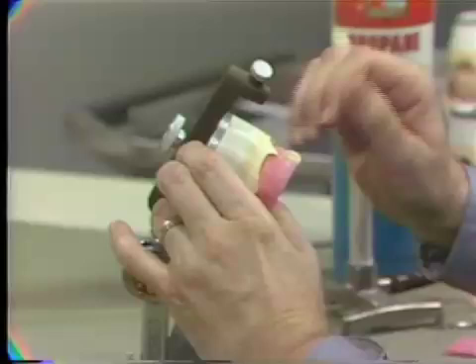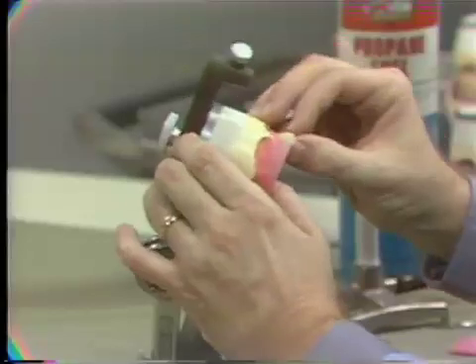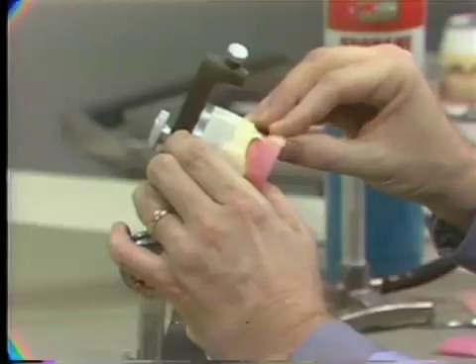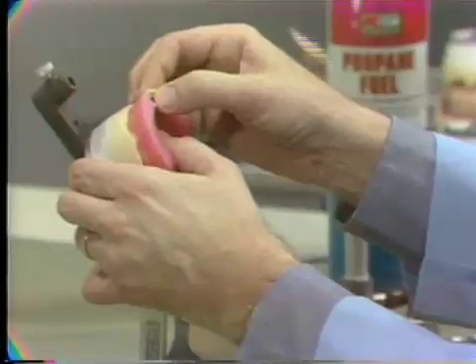Now the teeth that you have have lots of character to them. They're not like denture teeth that have been used before. They're selected from a mold of teeth made by the True Bite Company in York, Pennsylvania, called BioBlend teeth. They look very natural. They have character. You'll see the check lines in them and so forth.